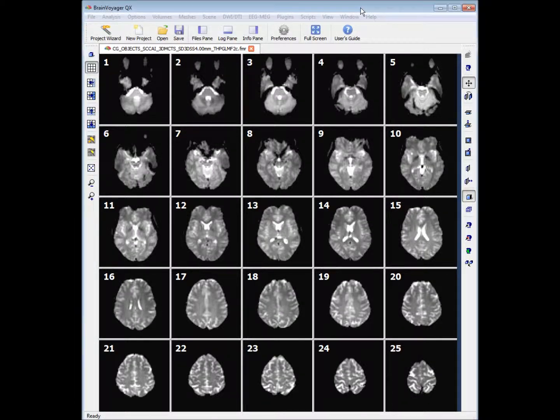In this tutorial we're going to look at statistical analysis using the general linear model. What the GLM allows us to do is to fit a model to our data using all of our predictors, so all of our experimental conditions. What it returns is an estimate for how well each predictor explains the variance in the time series at each voxel. We can also ask questions of the GLM by defining contrasts between our predictors to see if one or a combination of two or more predictors explains the variance in the time series more so than other combinations.